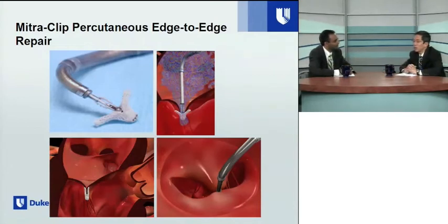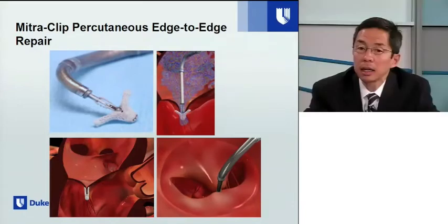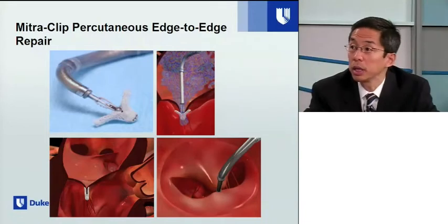Yes. Great question. So this is performed in a cath lab setting, but the use of fluoroscopy is very limited. In fact, it is done under general anesthesia mostly or solely for the purpose of transesophageal echocardiography, which is the guiding procedure for steering this device within the left atrium across the mitral valve, centering it on the jet origin, and really making sure that the leaflets are captured with the device. And I will bring up the importance of 3D transesophageal echocardiography, which really is amazing imaging to use in the cath lab.